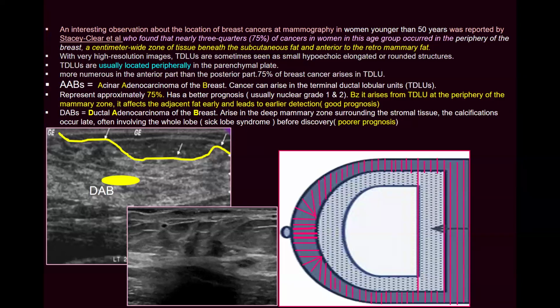I tried to join this information together in these slides. Being in premenopausal, because in postmenopausal the breast involutes and the number of TDLUs significantly regresses, as you know.